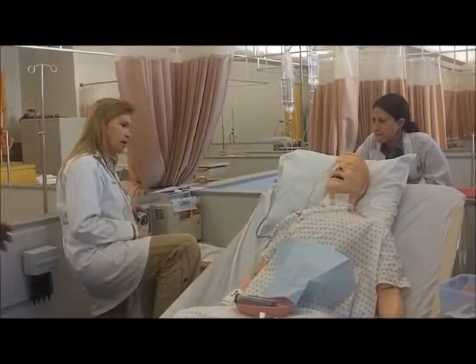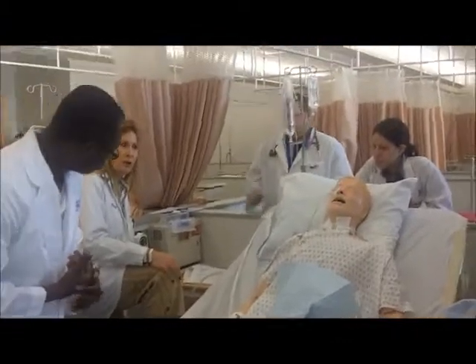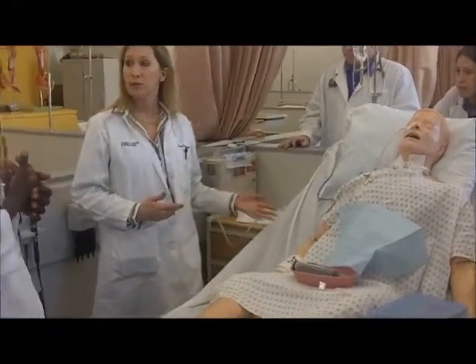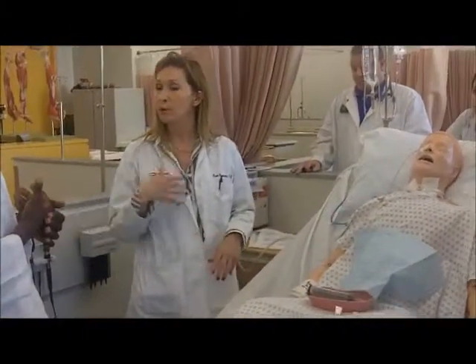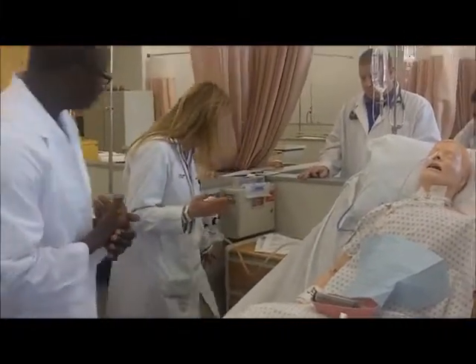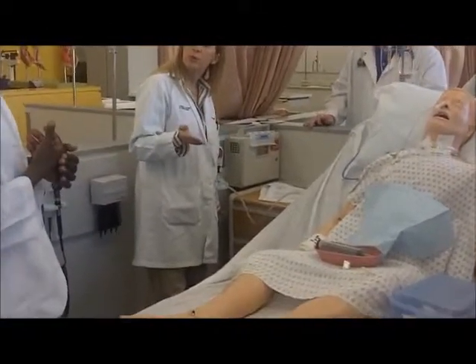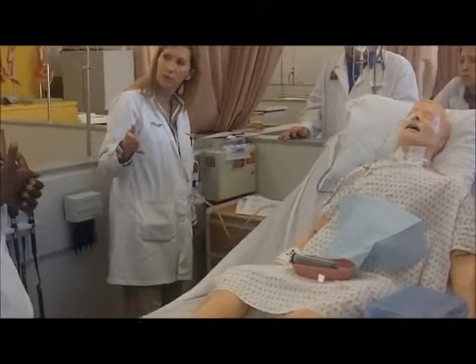At the end of your shift, you put a piece of tape on here, and you put the time and the date. I had 200 cc's out of this NG tube, so my credit is 200 out, it's output. Then when you leave your shift, you'd have 300, so now we're up to 500, and you take a credit of 300, you just deduct my 200. You see what I'm saying?